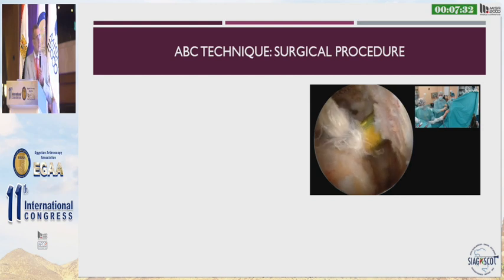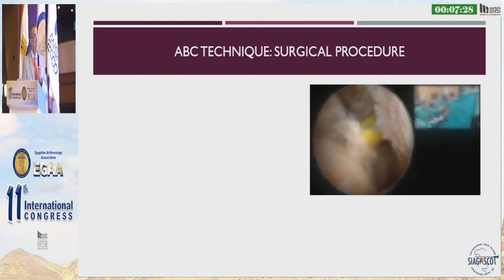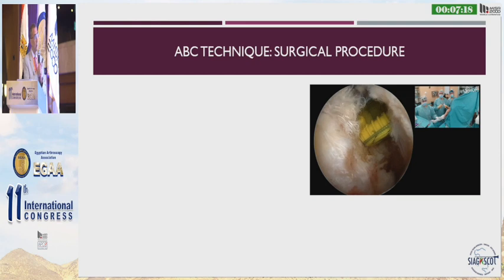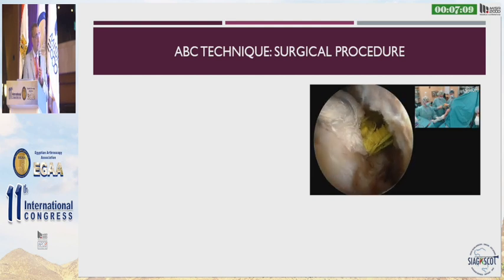So in this case, I will put the anchor laterally with a knotless anchor, and I will stabilize posteriorly, as we saw before in the design, with the long head of the biceps remaining attached on the glenoid side. This biomechanically pulls the humeral head down, but it's not enough.